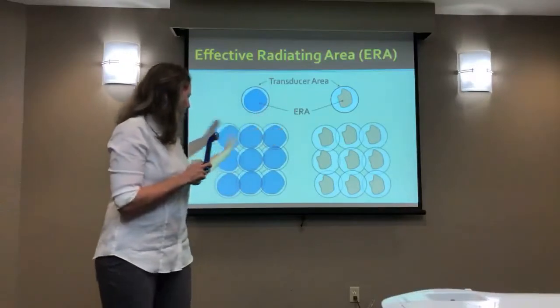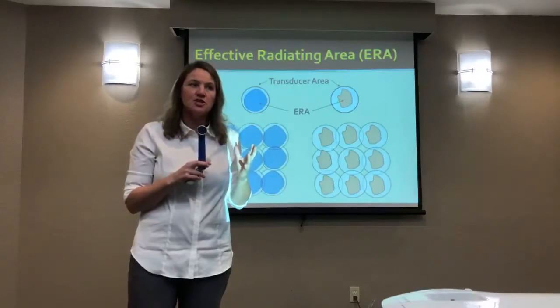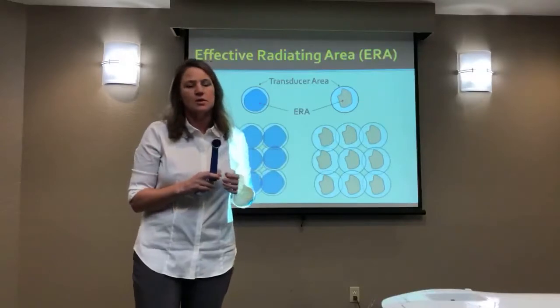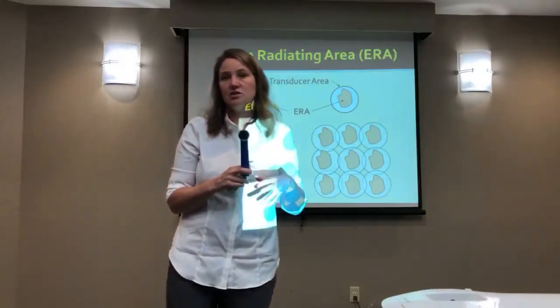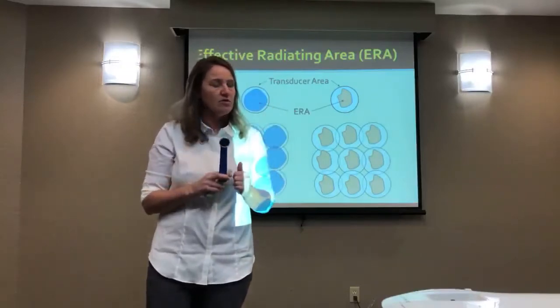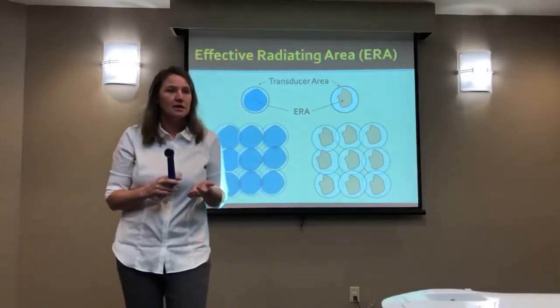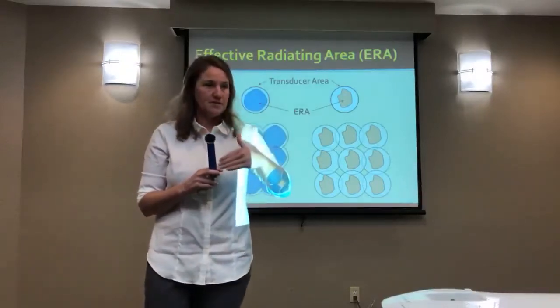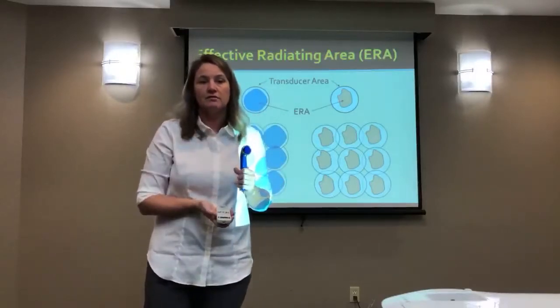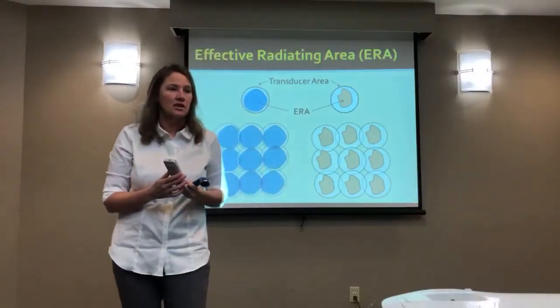If you were to cover a treatment area with the same exact method, you wouldn't get as much energy with a smaller ERA as you would with the larger one. So it doesn't mean you can't use the device. It just means you have to treat the area, a smaller area, if you want to get good outcomes. The reality is you're not always going to know this. When you have your equipment inspected, they should be checking this, and they'll be saying it's still within acceptable limits of what the label says, or they have to let you know that it has some discrepancy in the frequency, the intensity, and the ERA.